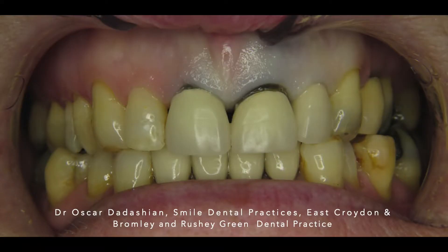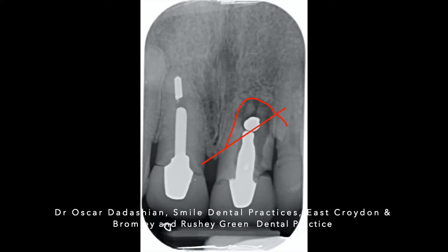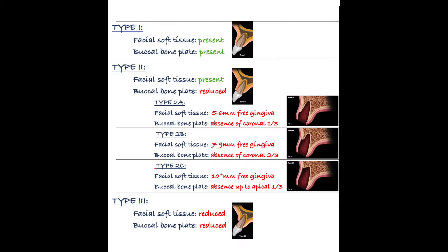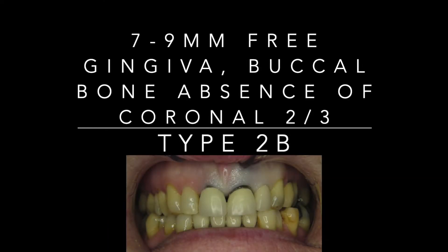Here we have a root fracture on upper left one. The roots have separated and that has caused significant bone loss, in particular with the distal bony peak. This is a type 2b extraction socket, where we have absence of the coronal two-thirds of the bone and we have seven to nine millimeters of free gingiva.